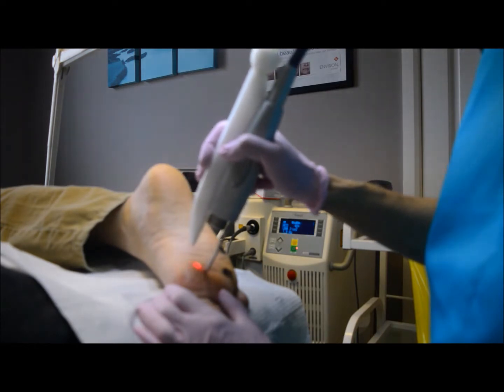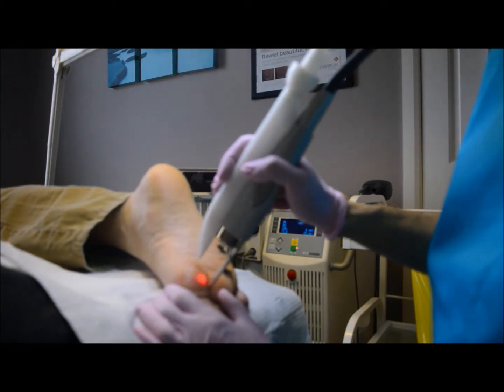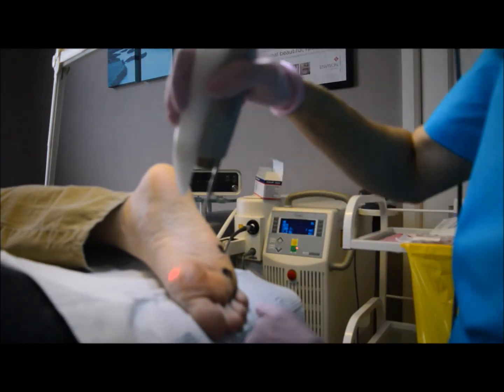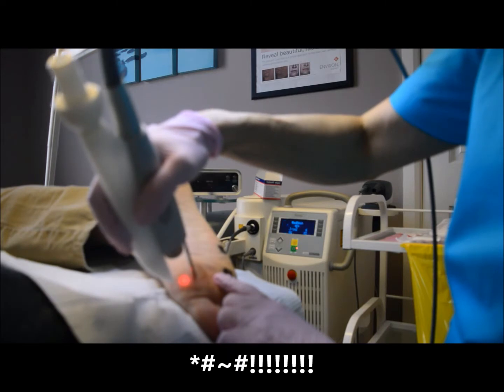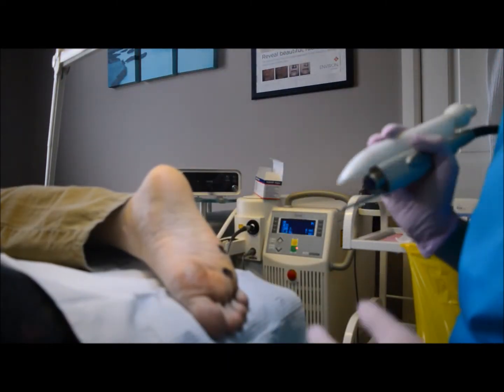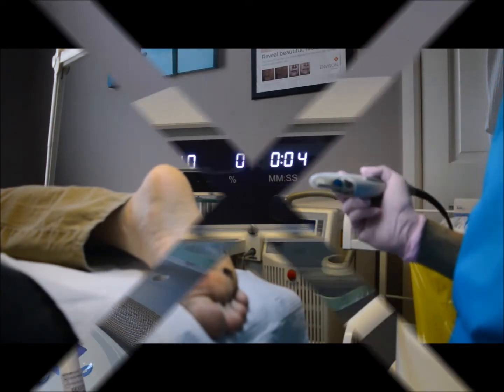You've got the chromophore of the blood and you've also got the analgesia in there — you can see it's lighting up very nicely. Now I'm going to try the same on the unanesthetized side. It's painful, so analgesia is a necessary requirement when you're actually doing laser treatment for verrucas.